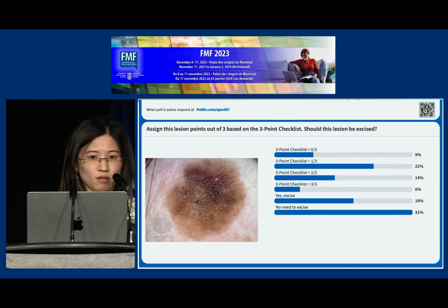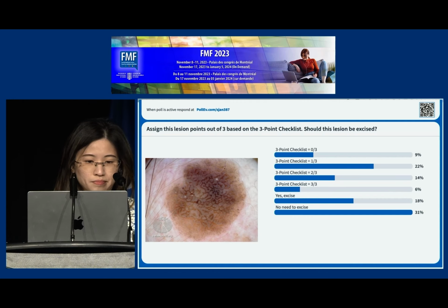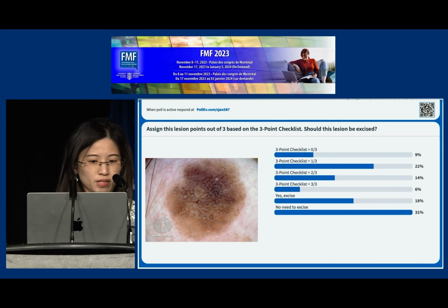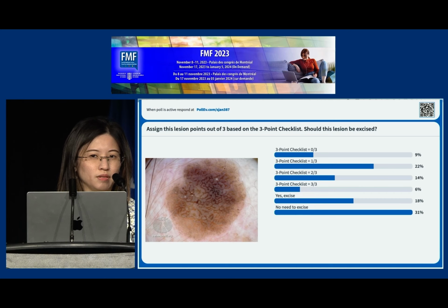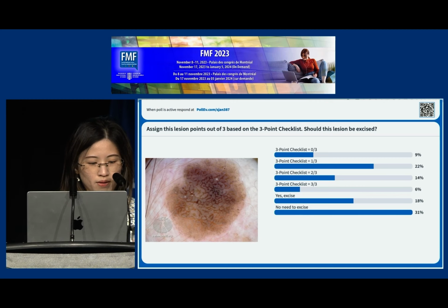It can look like a melanoma, it can look like a very classic SK that you're happy to leave alone. Another example of SK actually, so I would say pretty spread out, some 1, some 2, and some say 0. Pretty symmetrical, maybe atypical network, maybe a bit of white discoloration. I would say it's probably more from discoloration from the dermoscope pressing on the lesion. That's why it looks almost a little bit whitish, but I think it's just from the glass plate pressing on it. So 0 or 1, something that we're happy to leave alone.